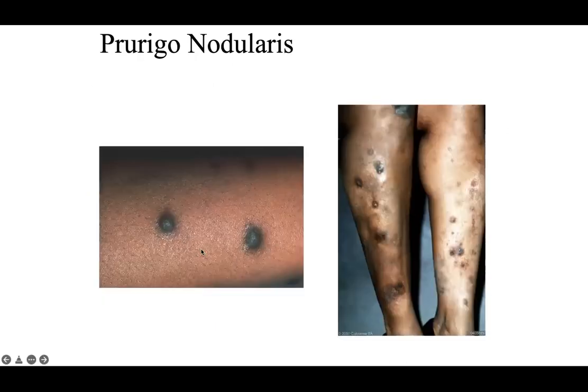So here, you might be even thinking this could be a dermatofibroma, and you often get prurigo changes overlying a dermatofibroma because it's itchy. So anything that's itchy can have superimposed prurigo changes. You can have cancers that are hiding in the center of something that's a prurigo-like nodule. So many times I will see biopsies that have a central skin cancer or a central hypertrophic actinic keratosis or something to that effect with surrounding prurigo changes.